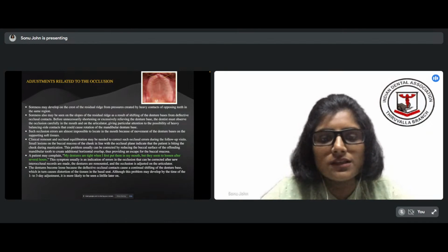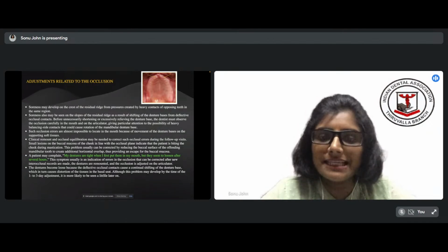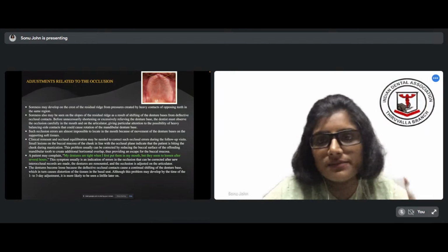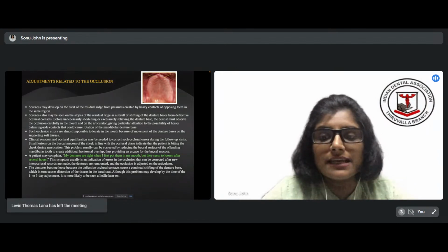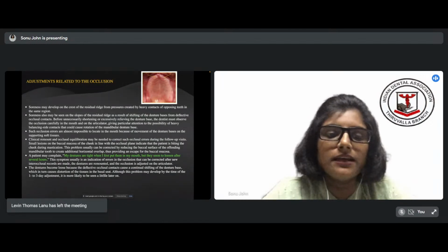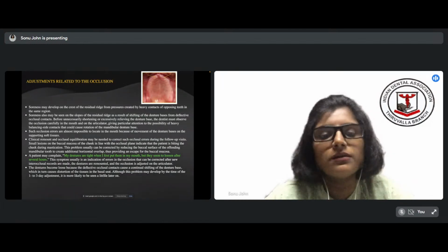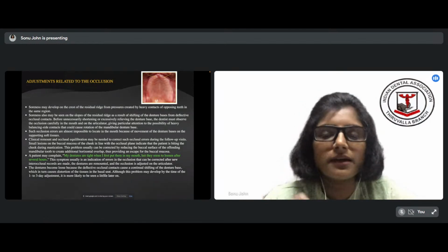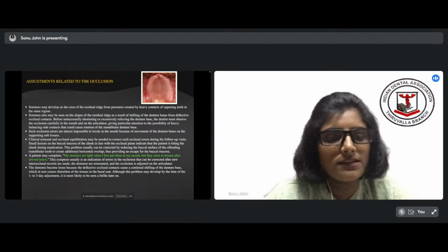Small lesions on the buccal mucosa of the cheek, in line with the occlusal plane, indicate that the patient is biting the cheek during mastication. This can be corrected by reducing the buccal surface of the offending mandibular teeth to create additional horizontal overlap so that your buccal mucosa can escape through that space.